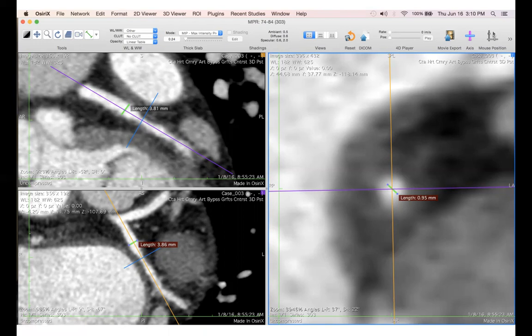We've done a lot of studies on looking at what happens when you get a very small cylindrical device or object in a scanner, and it just gets dimmer, right? Globally dimmer. The full width at half max doesn't change. So especially down here at around a millimeter or below, you have to somehow learn how to read these. And most clinicians who read CTs accurately actually look at the brightness of the vessel to report on the significance of the lesion or the severity of the lesion.